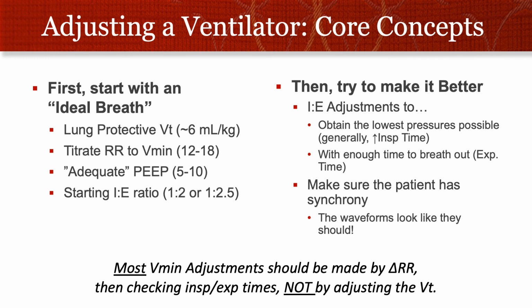And then after those things, and every time I make an adjustment, I make sure the patient is synchronous. The waveform should look exactly like the pictures I've shown you, and if they don't, I try to figure out why. And finally, I'll note that in general, if you find yourself adjusting CO2 by adjusting the tidal volume, you're probably doing it wrong. In general, once you've picked the perfect breath, leave it be. You've picked a good one, let it be the perfect breath, and adjust your minute ventilation needs by adjusting the respiratory rate.